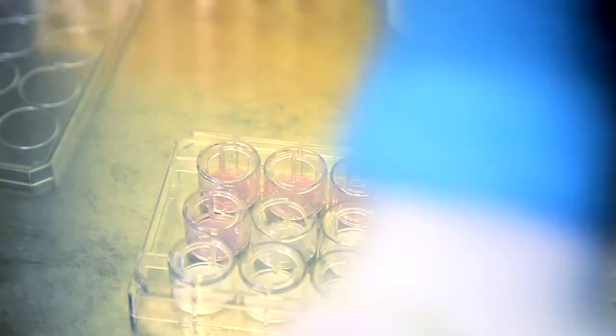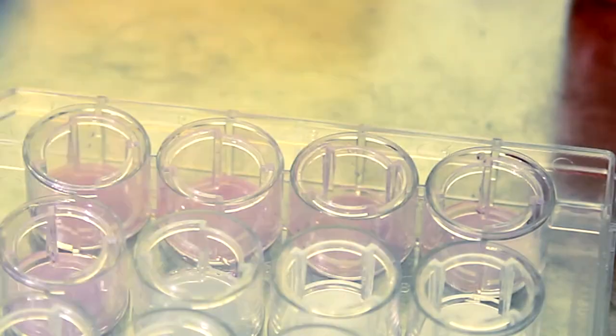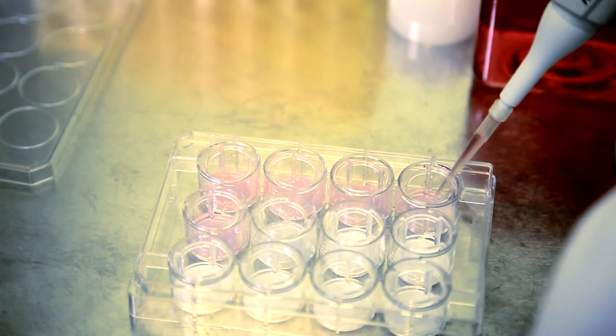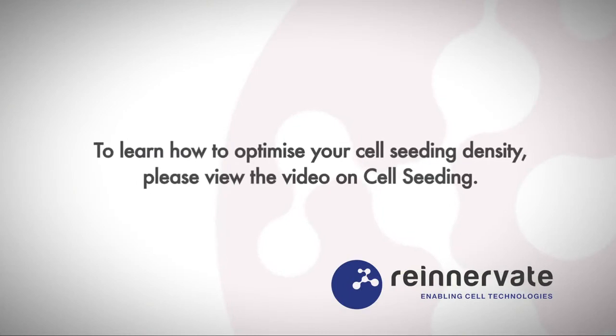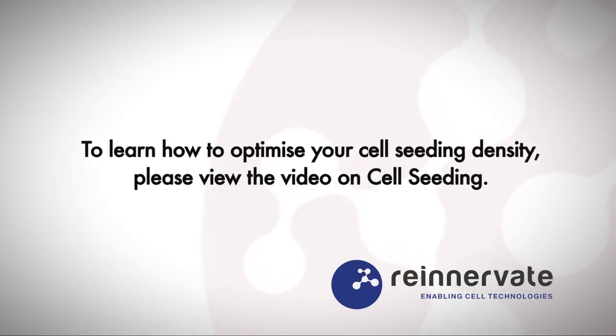When ready, seed the cells on the middle of the disc, being careful not to touch the membrane. 3D cell culture is different from conventional 2D cell culture as the cell seeding density must be optimised according to the cell type. To learn how to optimise your cell seeding density, please view the video on cell seeding.